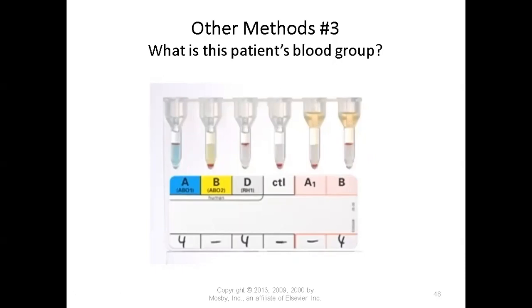It's a discrepancy, and we have to figure out what's going on. We're going to be building on that when we get into ABO testing in a future lecture, okay? So here, this gel card is telling us the patient is A positive, they have anti-B, and that makes sense according to Landsteiner's rule.